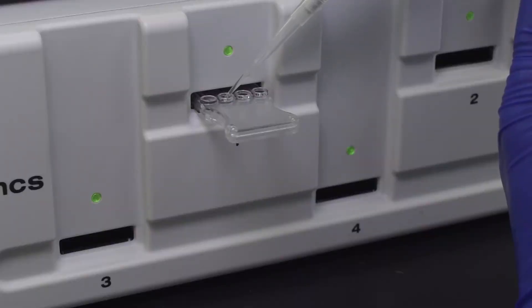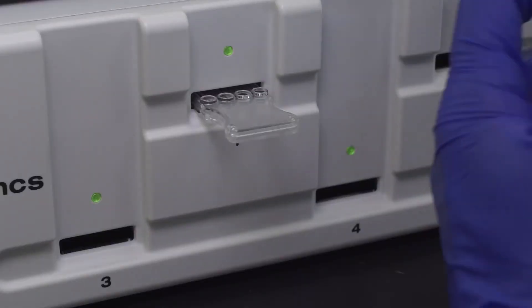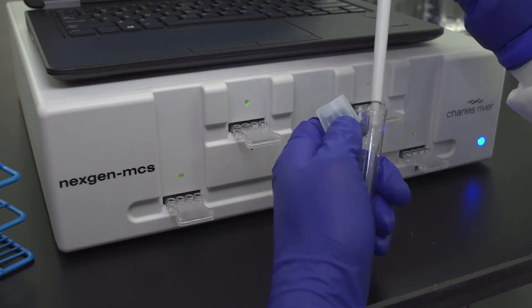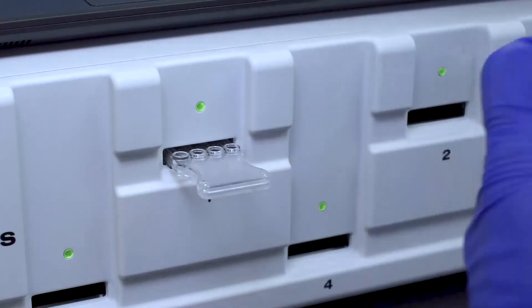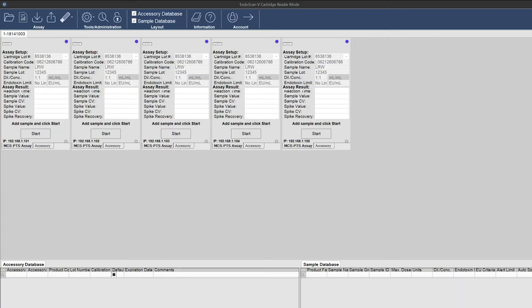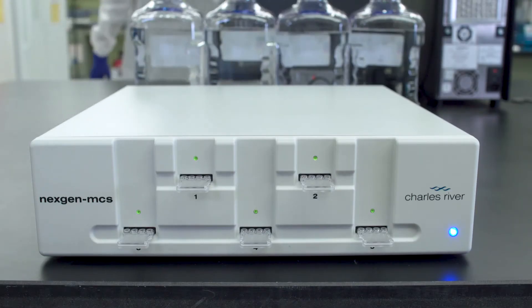Carefully pipette 25 micro-liters of sample into all four sample reservoirs of the inserted cartridge. To do so, hold the pipette so that the tip is at an angle and not completely at the bottom of the sample reservoir. Press Start within EndoScan-V after each sample has been added to the cartridge. Repeat this procedure for four additional samples.